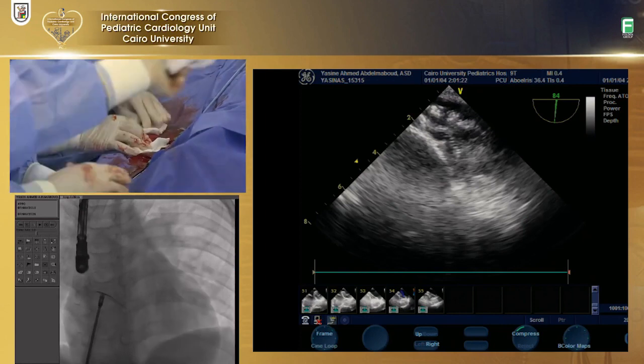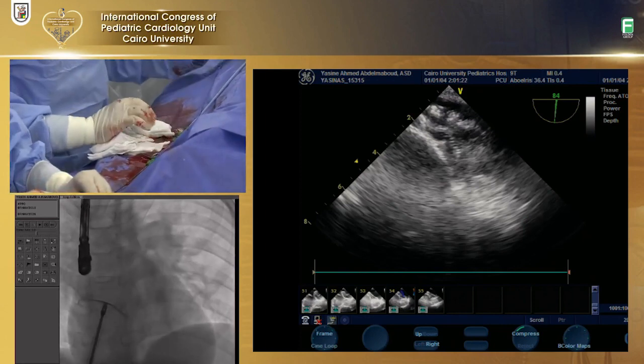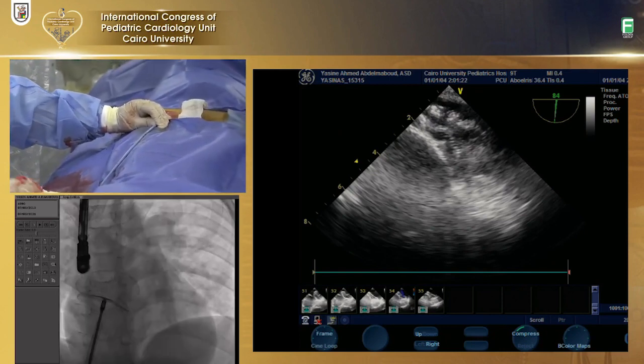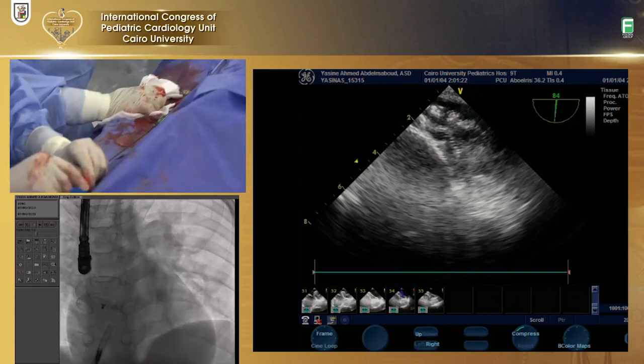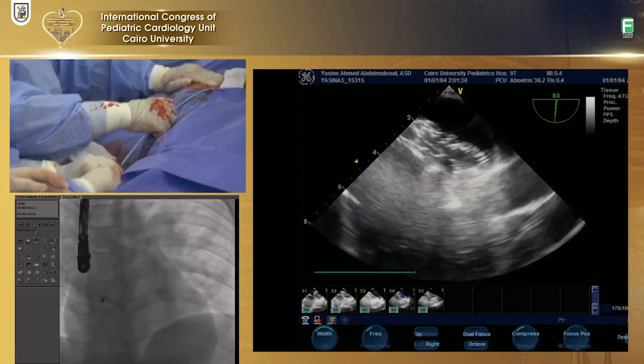Now we'll deploy our system. Sahar? No, the other one is not. Okay. Well and good. Go down. So go to the TE again.